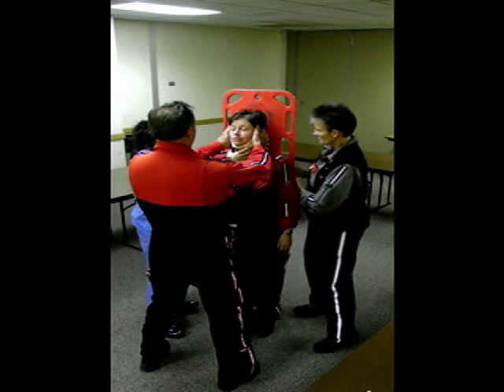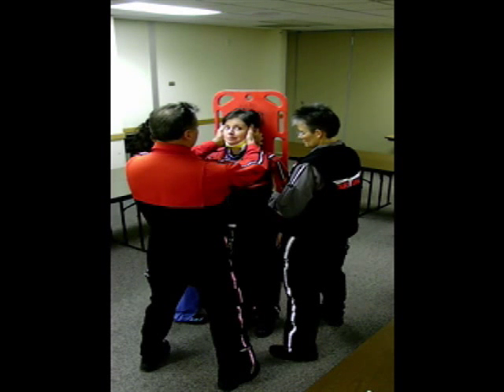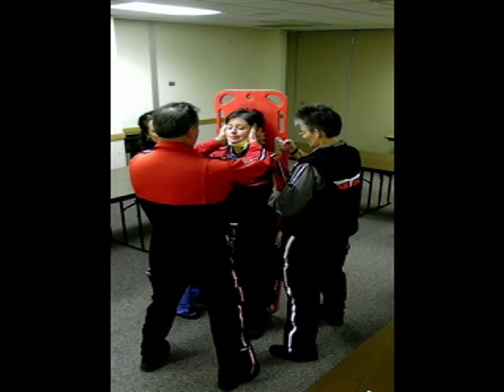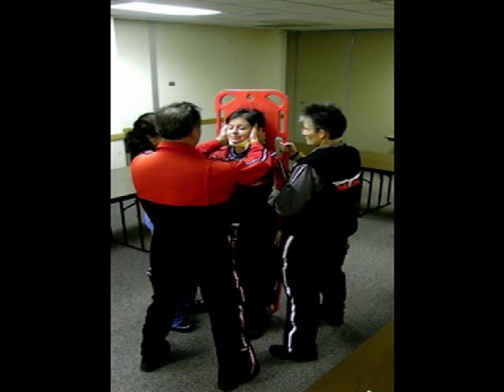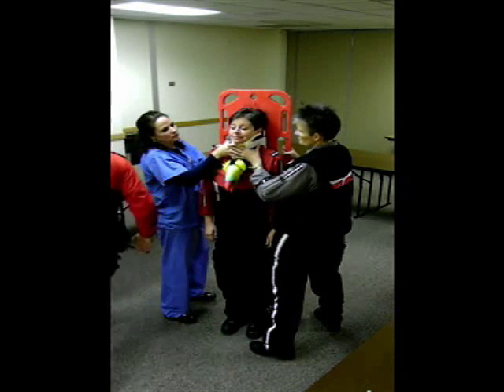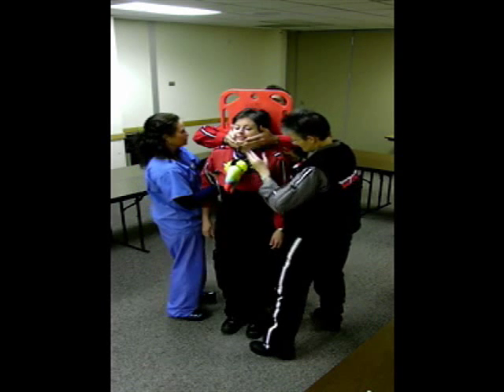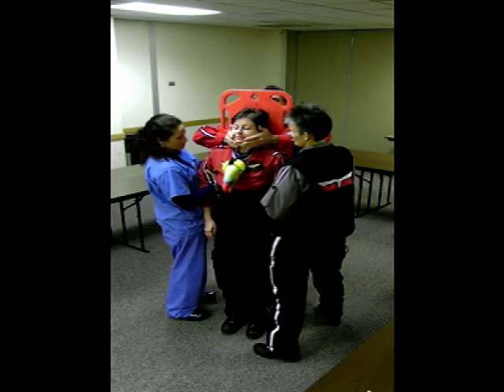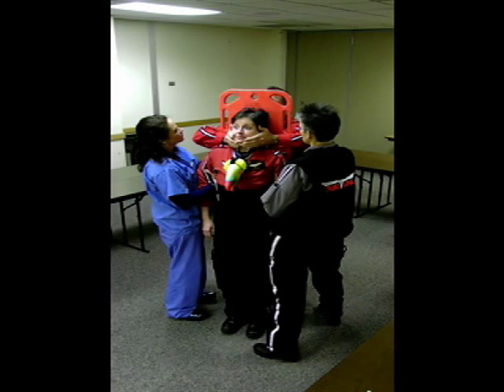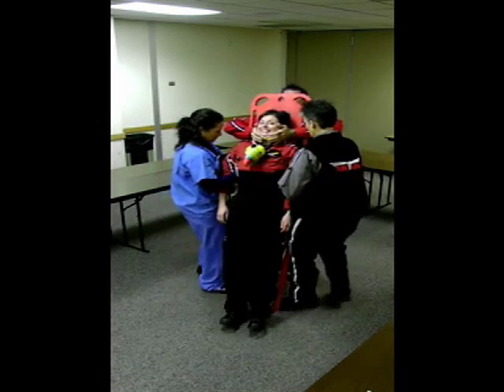The next thing we're going to do is place the backboard directly behind the patient. We're going to place a rescuer on the right and left side of the backboard. They're going to place one hand on the board to support it as we lower it, and their other hand will support the patient under their armpit. I've got to get around to the back to maintain C-spine, so they're each going to take a hand on each side of the neck and hold the patient's neck in place. A tall person works well to go behind the backboard. I'm going to assume C-spine here, and the two rescuers are now going to place their hands under the patient's armpits so the patient doesn't slide down the board as we move back. When everybody's ready, we're going to move as a unit and lower the backboard down. On three — one, two, three. Nice, slow, controlled movement.